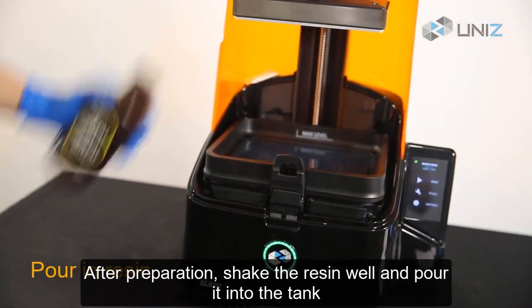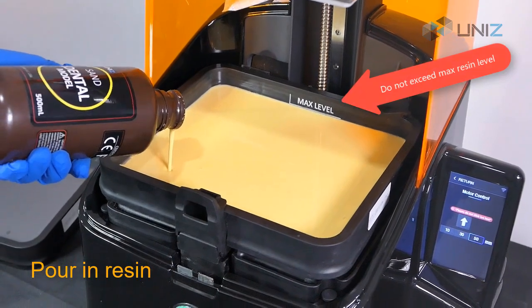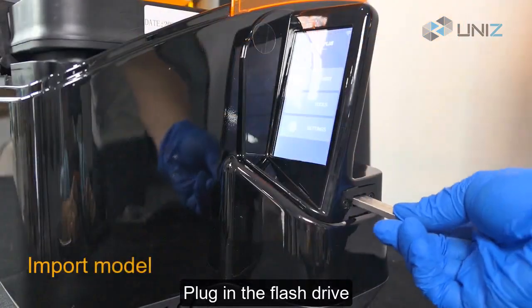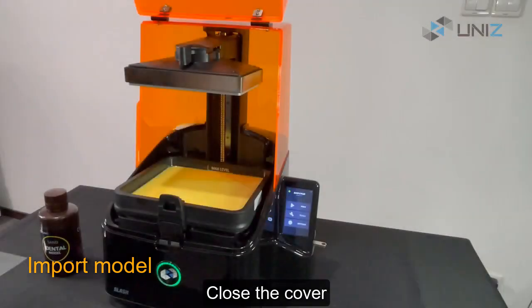After preparation, shake the resin well and pour it into the tank. Beware of the max resin level. Plug in the flash drive. Close the cover.